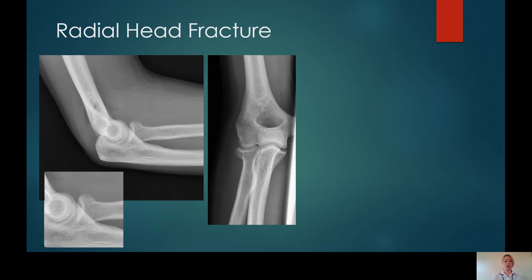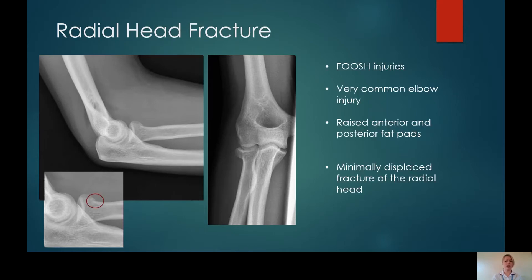Radial head fractures are commonly seen through A&E. They are caused by FOOSH injuries, and the most obvious thing you should be able to appreciate is the anterior and posterior joint effusion on the lateral elbow X-ray — so already you know that there will probably be an injury present even if you can't see it. The lateral elbow can be a quite subtle example of a radial head fracture, where there is a very subtle disruption of the bony cortex. It is a more obvious injury on the AP X-ray. They can be very, very subtle.